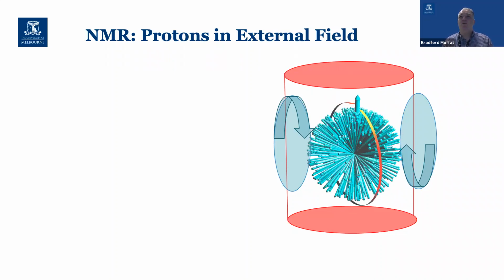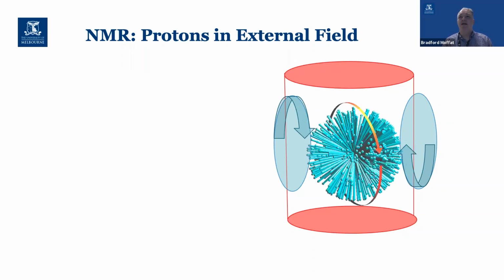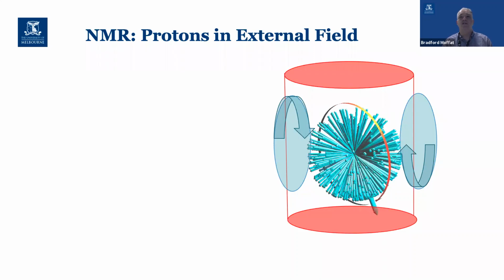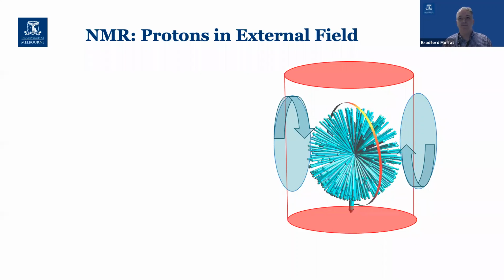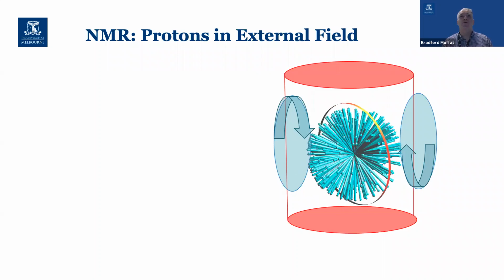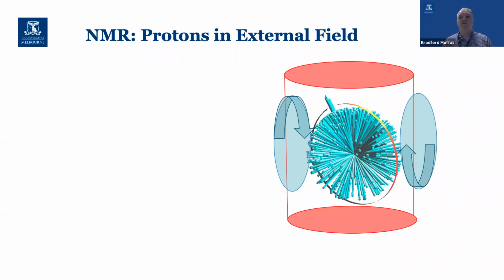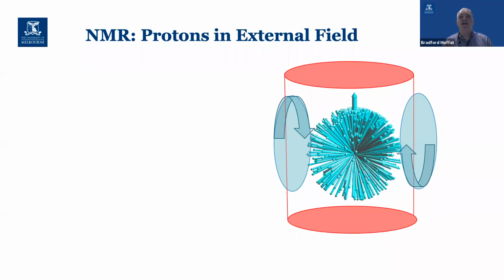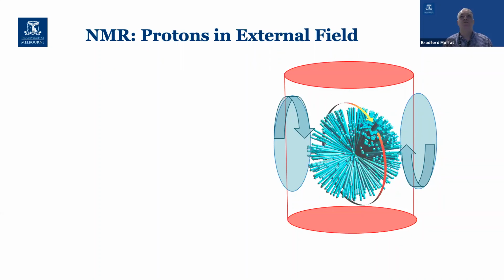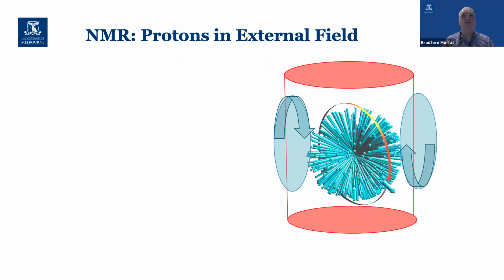While we would get a lot more signal if water protons were a lot more magnetic, because they're only weakly magnetic, they have some quirky phenomena that we can make use of to do the nuclear magnetic resonance experiment and even magnetic resonance imaging. And the phenomena that I'm talking about is that, at the quantum mechanical level, these protons resonate or rotate about the main magnetic field at very high frequencies in the radio frequency window. And that allows us to detect these radio frequency signals, and they're modulated by their physical and morphological environment and even their chemical environment. And so we can pick up signatures that tell us a lot about the biology that's going on.